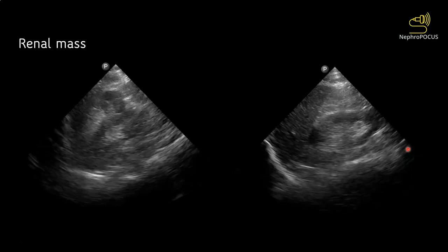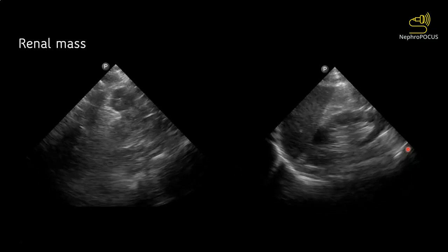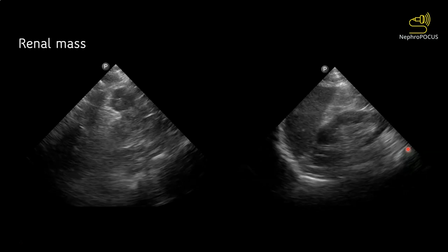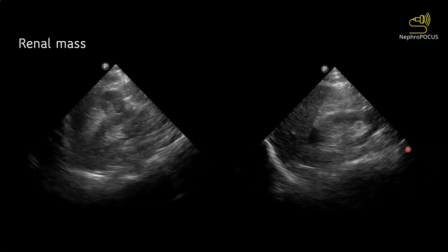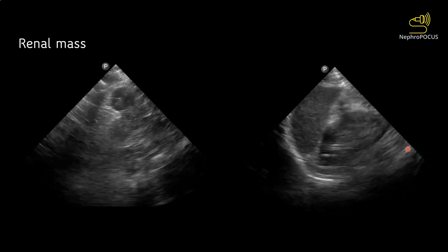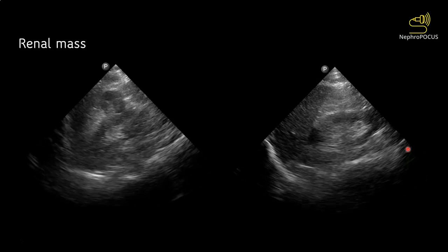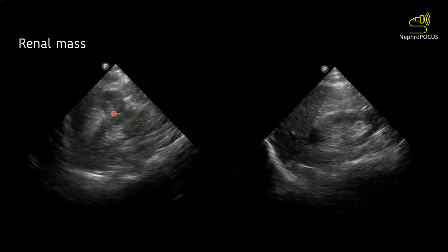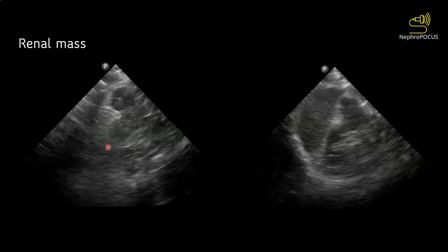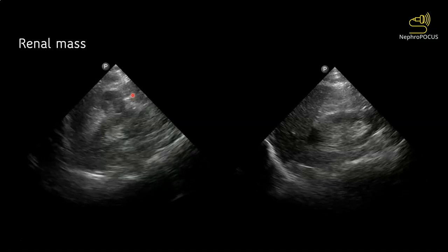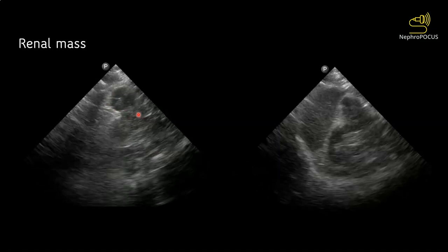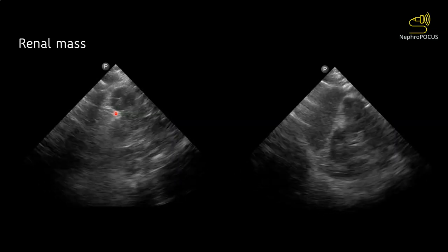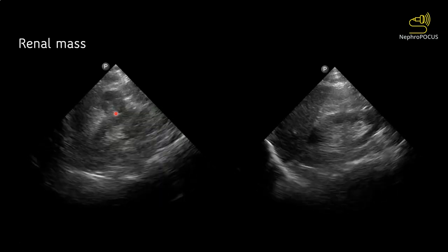Here is another example where this image was obtained using a phased array or cardiac probe. Generally, image quality is not as great with a cardiac probe, but despite that you can see that the kidney outline is disrupted with an outward-growing mass, and this was also diagnosed as renal cell carcinoma.